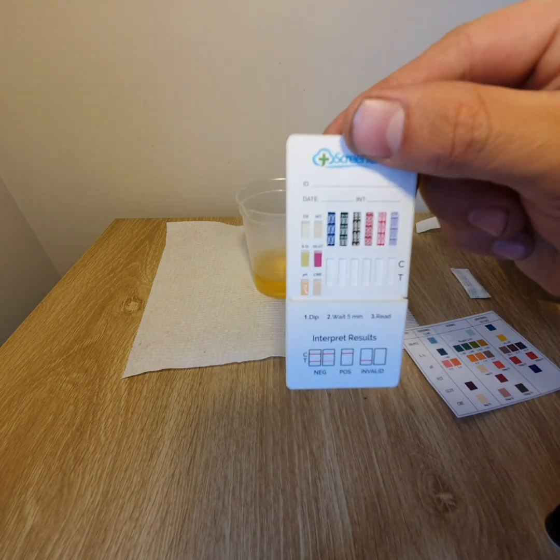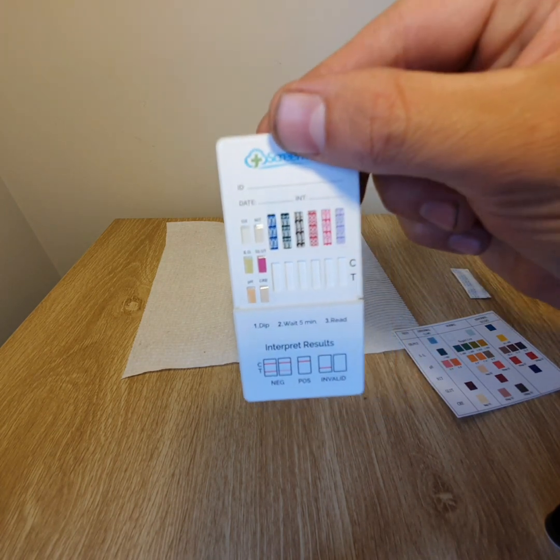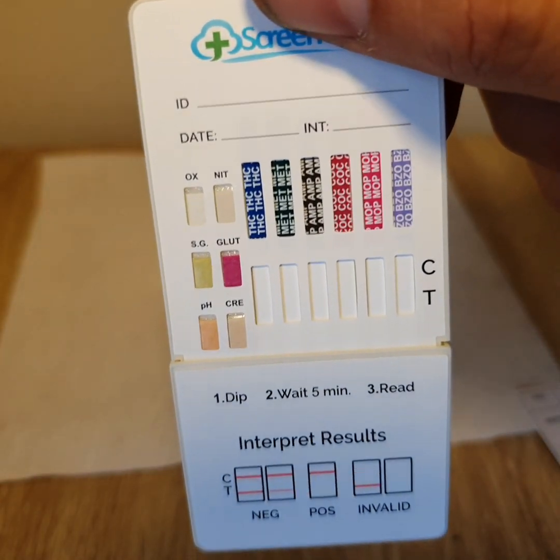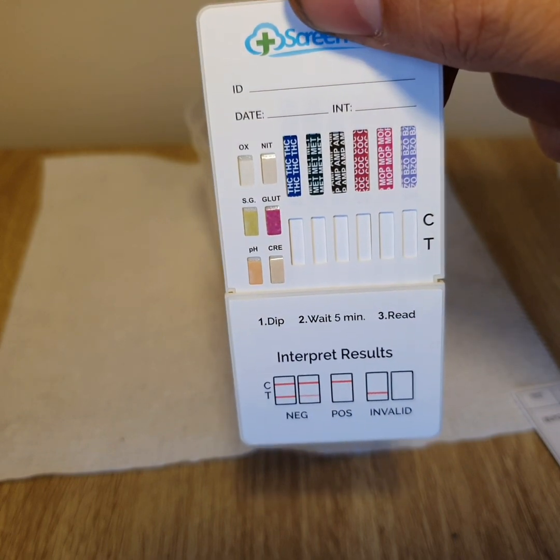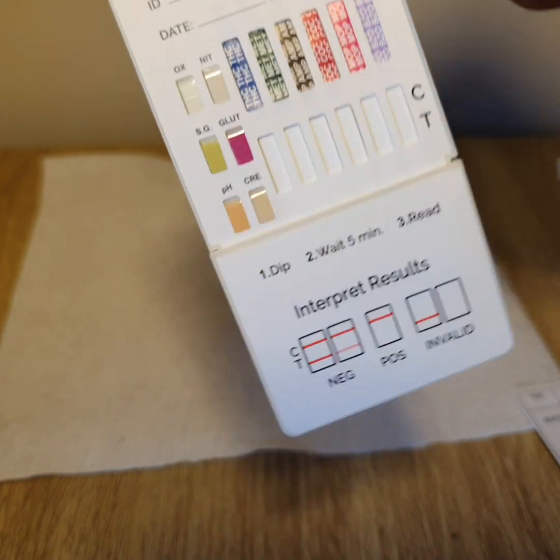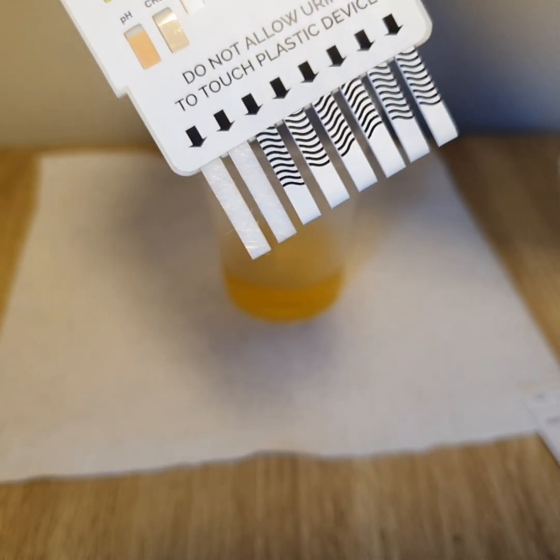Now as you can see, there's the adulteration test with the six different block colours on the side, and of course the six drugs being tested. There's also a spot where you can write the name of the person being tested on top and the date if need be.